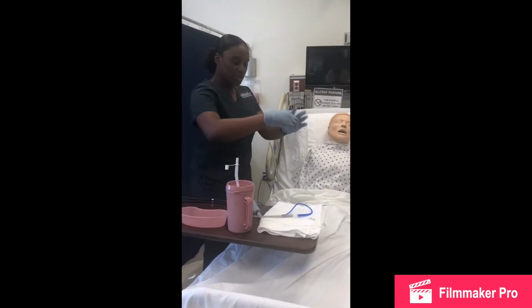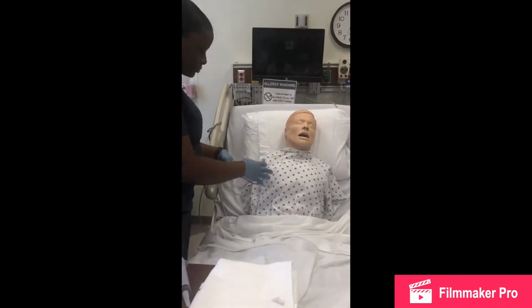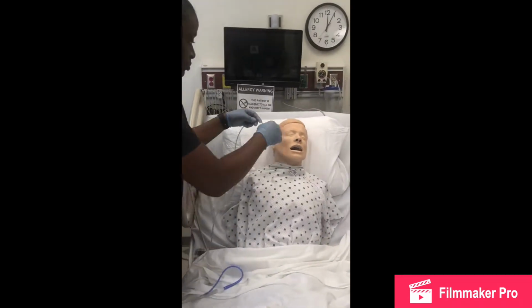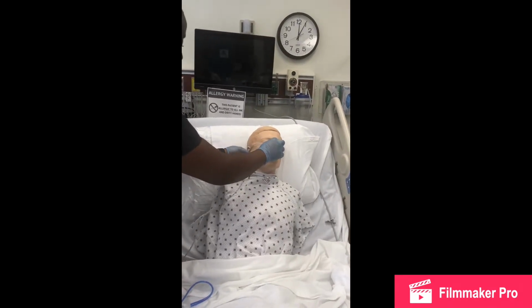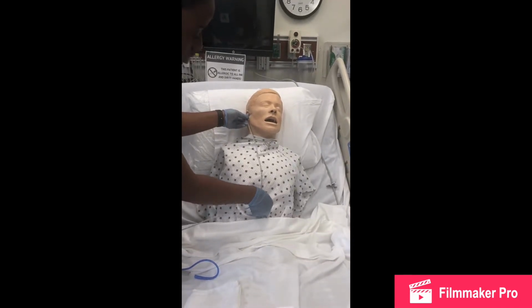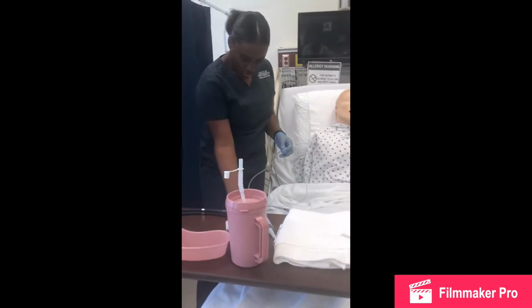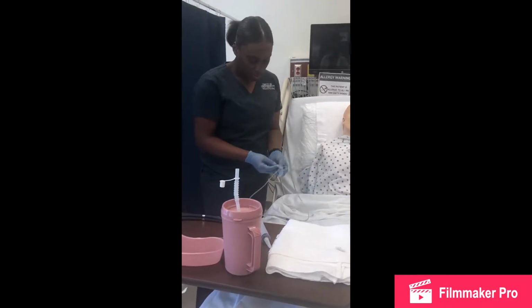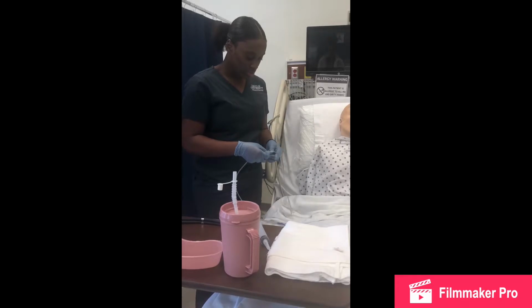I would then take my NG tube and measure it by placing it at the tip of the nose to the ears and all the way down, just a little past the xiphoid process. I'll put one of the tapes around that just to mark it so I don't go past that.